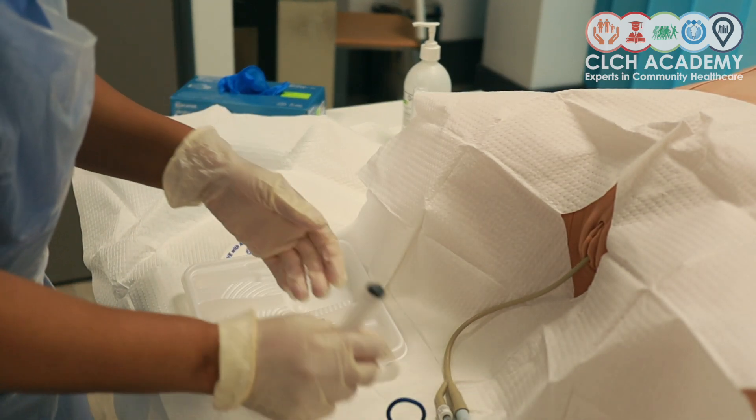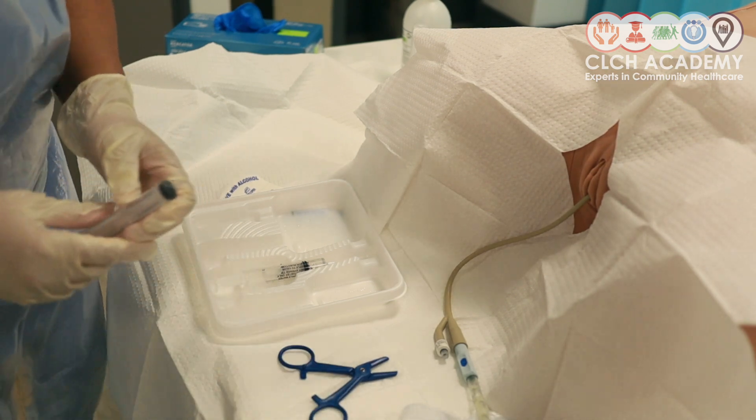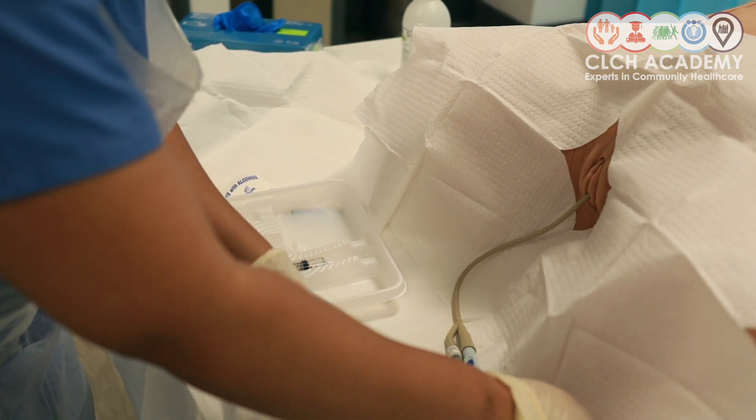Then send it off to pathology. Having collected my sample, I would then remember to release my clamp, because I don't want my patient to have a blocked catheter because I've left the clamp in situ.